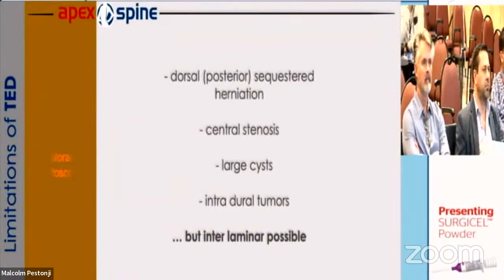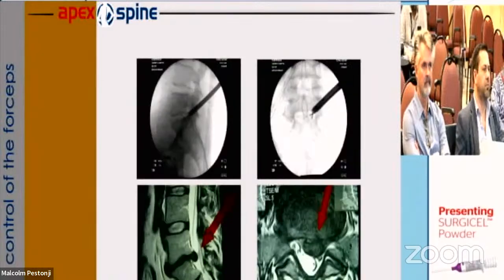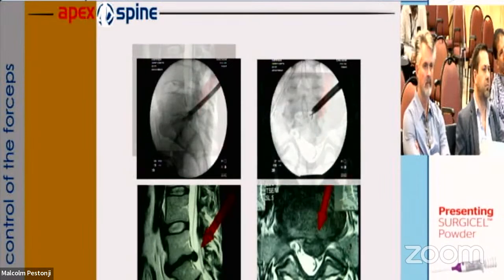And what is something very important, what are the limitations of the transforaminal endoscopic procedure? For me, there are the limitations of dorsal or posterior sequestrated disc herniation. You can't reach it in transforaminal very well, or central stenosis, large cyst, or intradural tumors, but interlaminar is still possible. Examples. Here you see just a normal disc herniation L5-S1 to the left side. And here I will bring in the MRI to the X-ray control, and you will see that the positioning of my forceps is exactly at the right spot.